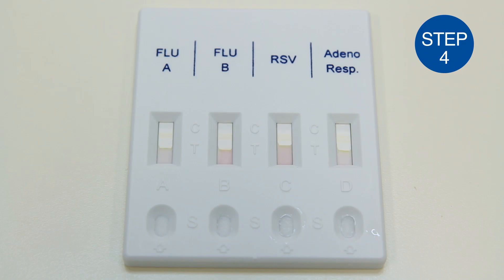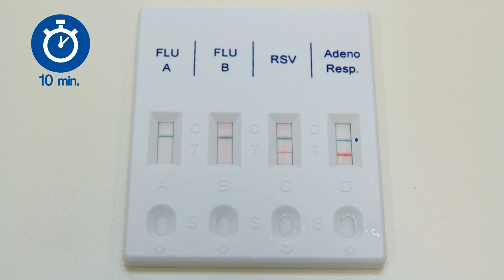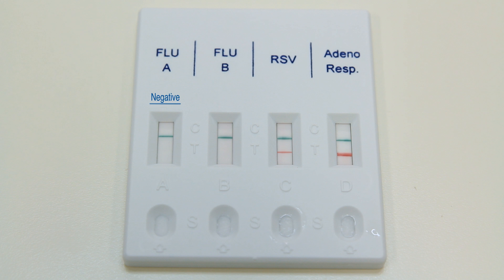Step 4: Wait for coloured bands to appear and read the results at 10 minutes. The intensity of the red coloured lines in the result window will vary depending on the concentration of antigens present in the specimen. However, neither the quantitative value nor the rate of increase in antigens can be determined by this qualitative test.